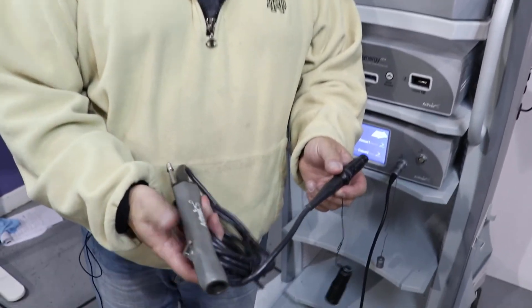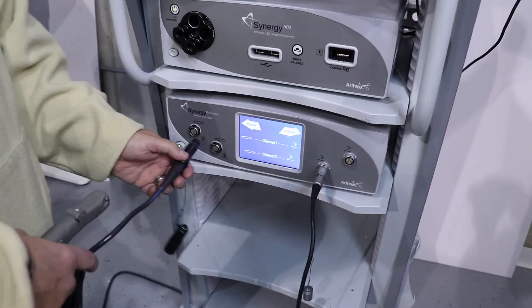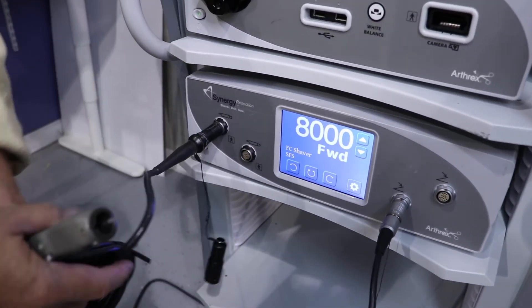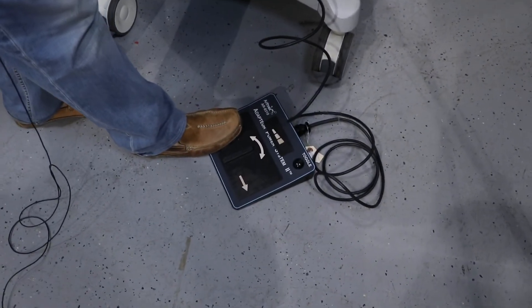For the purposes of this demonstration, we have a foot control shaver and a foot pedal. Basically, what you would do is plug in the shaver handpiece into the console, make sure your foot pedal is connected, and then to operate the actual shaver, you would step on it.